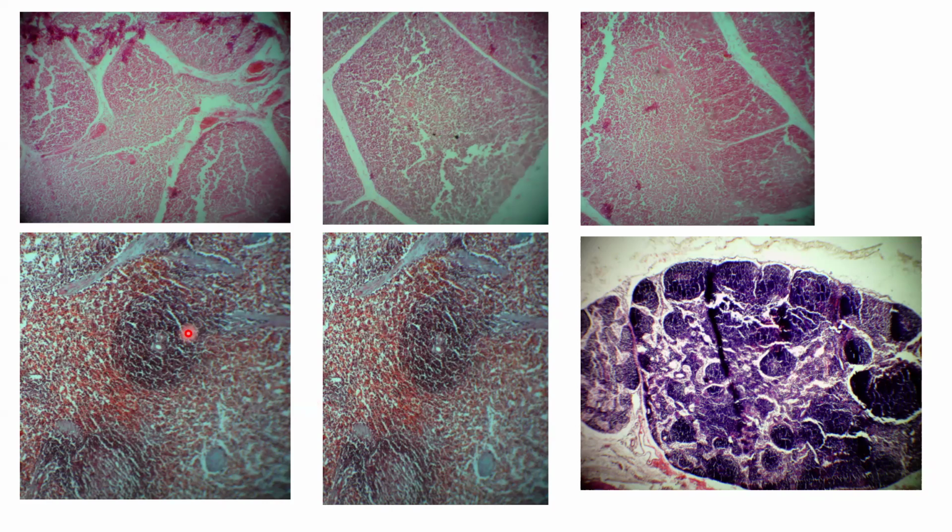And now these two images are showing us the spleen. I hope you're able to identify this as the white pulp with the central artery. So the whole of this is actually the white pulp. This is the red pulp here. White pulp. This is now the periarterial lymphatic sheaths. Incomplete trabeculae. Yes, so that is it. This was a slide on the spleen.